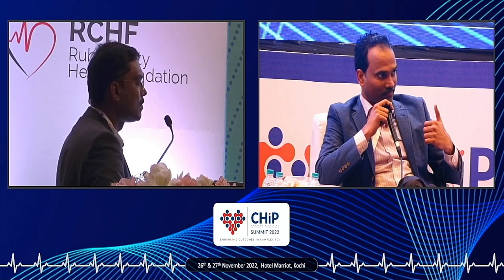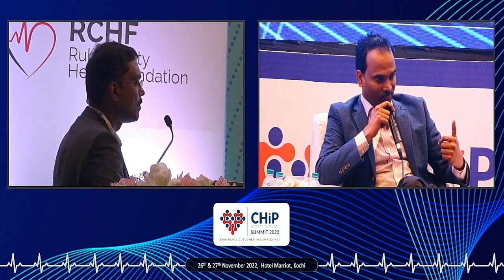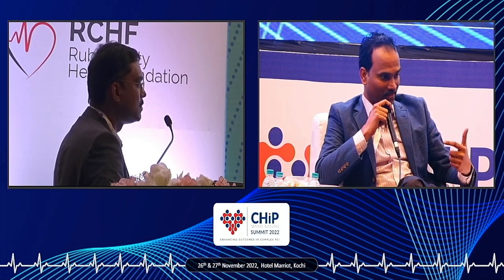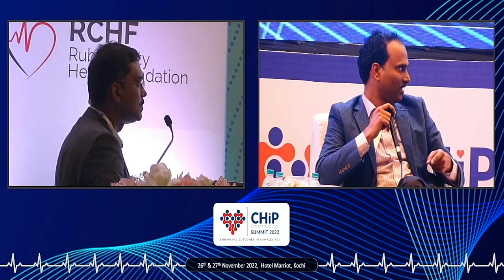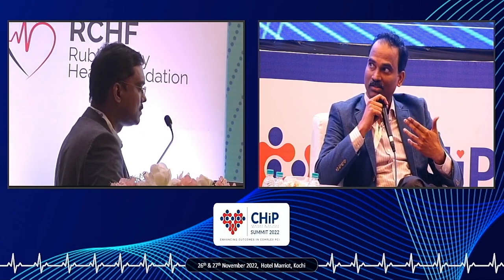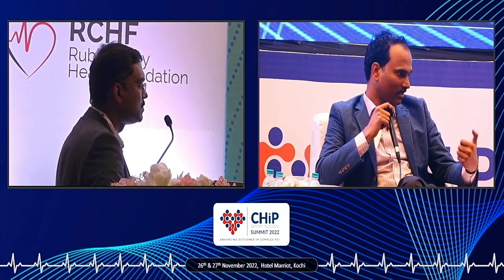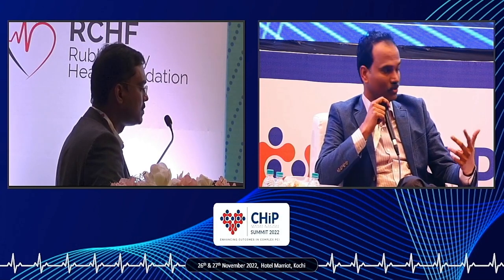So, if the pathology is under-expansion of the stent, and the reason for under-expansion is calcium, once you have deployed a stent and it is under-expanded, your options are limited. So again, in those situations, laser comes to your rescue. You can use IVL, but laser is one modality. So it's diffuse intimal hyperplasia, and under-expansion where the reason is calcium sitting behind the stent. I think these are the two situations.